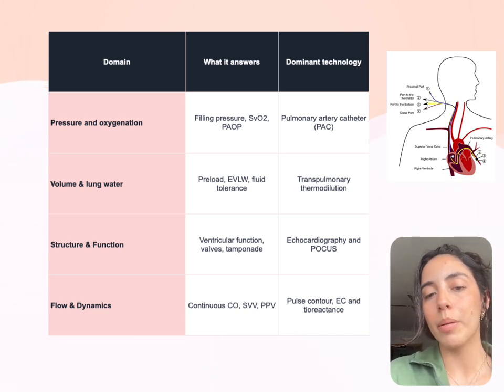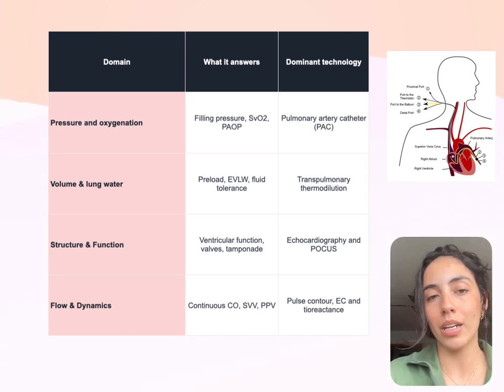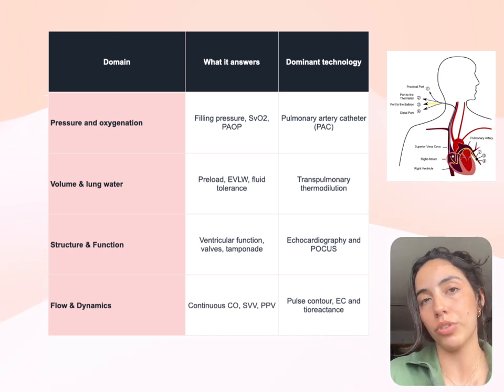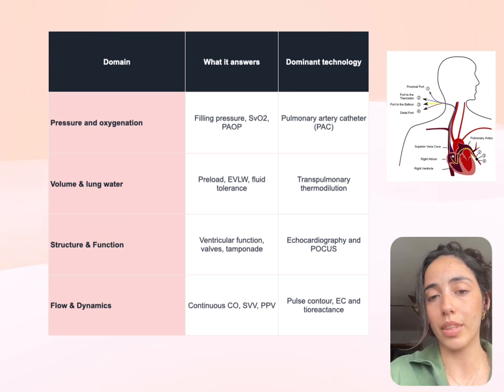The way in which it works is we inject a solute that has a specific temperature, and through the measurement of the gradient of change in the temperature, we can estimate the volume that the patient has. This is also done not only through temperature changes, but through the rate of dilution of, for example, lithium in specifically transpulmonary thermodilution. However, this is limited to an extent, as we cannot indefinitely inject a patient with lithium to understand and see the degree of change that the concentration of lithium has. And it's also obviously contraindicated in several patients.